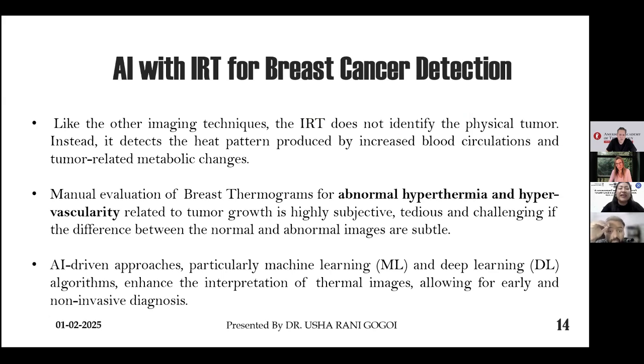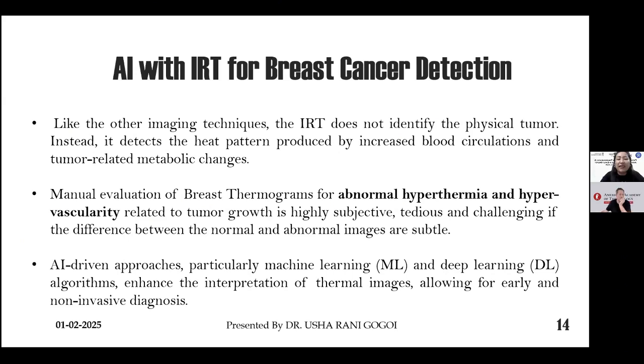Since it gives a temperature profile of the female breast, there is a transition of temperature from the higher region to the lower region. There is no sharp boundary in the thermogram, so we can't directly apply the segmentation method. It is also not possible for the doctors to mark precisely the boundary up to where we should consider it the tumor region.